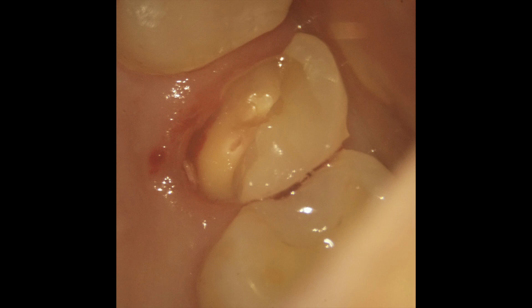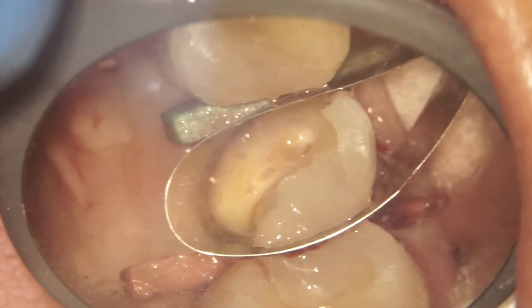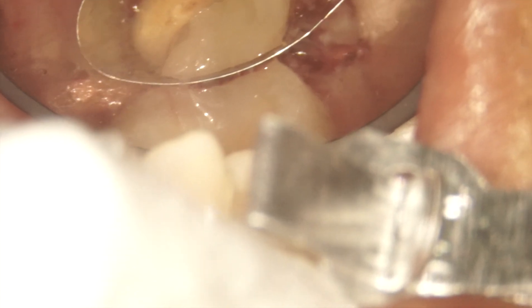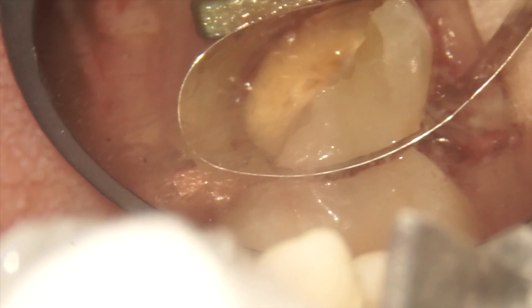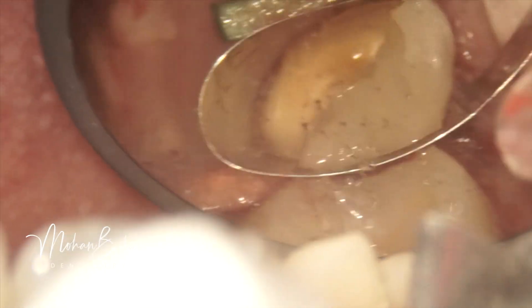To do a proper pre-endo buildup with composite material, we definitely need very good isolation. Generally in these kinds of cases we use an auto matrix, and around the auto matrix we place a split dam. The gap between the matrix and the split dam is sealed with liquid dam. However, to achieve a proper seal between the matrix and the gingival margins, the margins must be accessible — but in this case they were too deep, almost 3 mm.